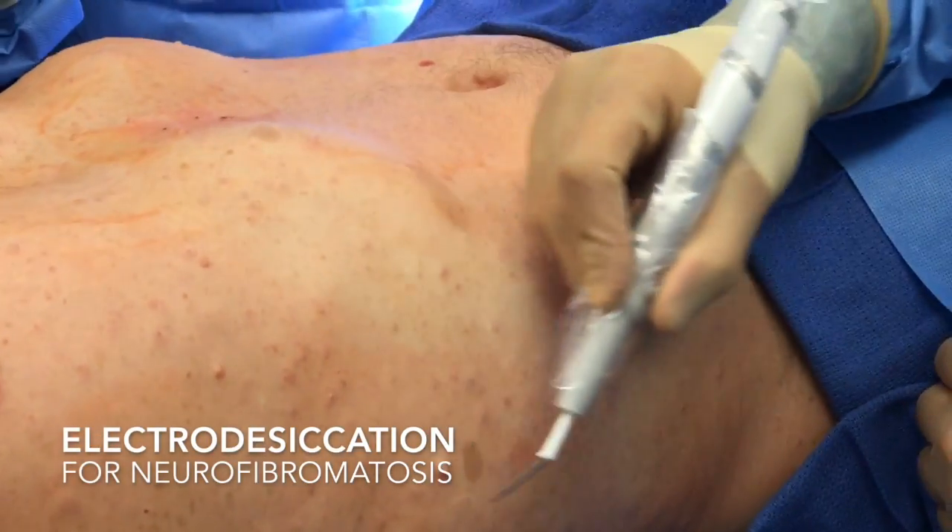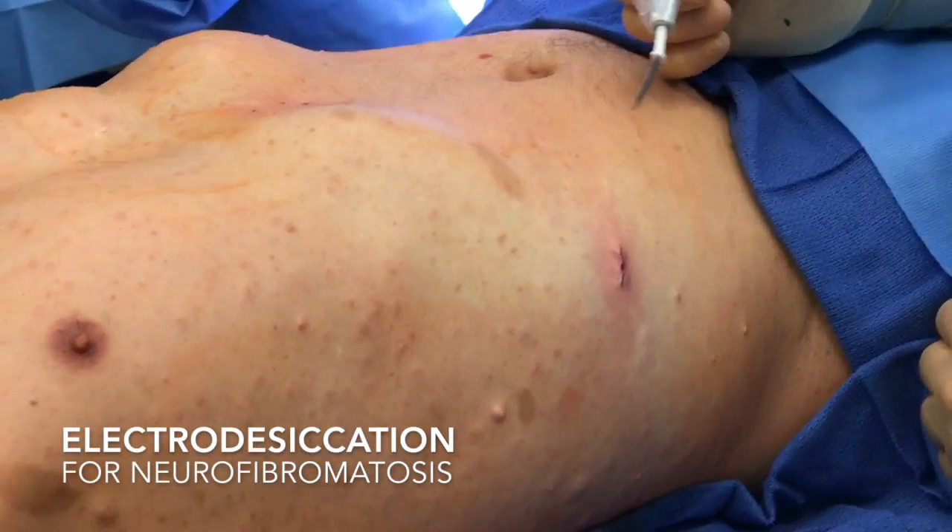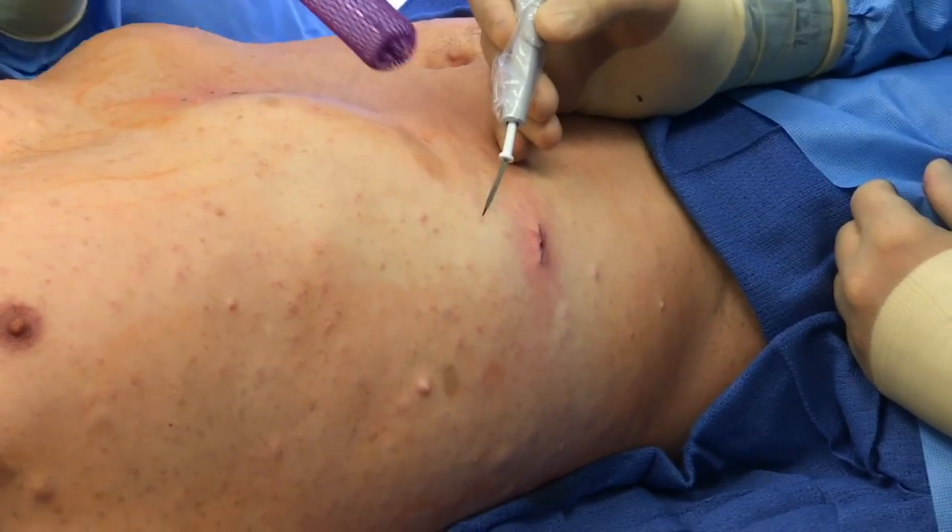I'm going to do a round of electro-desiccation on all these small lesions all over the place. So this is how that looks.